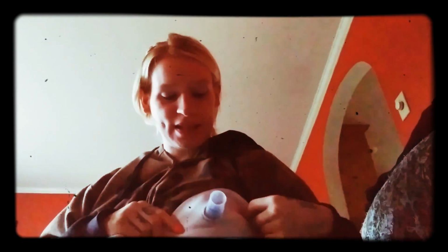Alright, so I finished cutting the hole to the best of my ability. That's what I came up with. This will just go on the inside, so when I go to pump, I have this on, I put this in, and it'll go like this, and it'll attach. Now, to make sure the seam isn't all over the place, I'm going to take some thread and a sewing needle and go around the hole. You can use a sewing machine, but I prefer to hand sew everything. So I'm going to do that real quick, and then I'll show you what is next and what it looks like together.